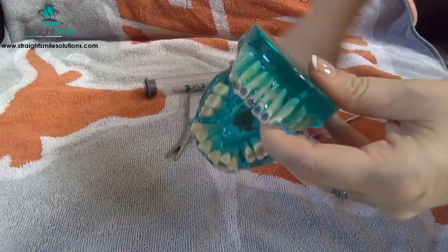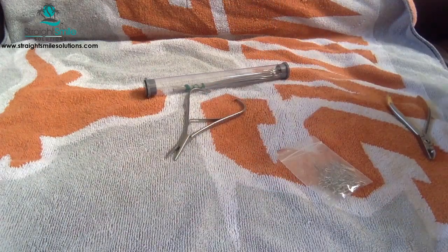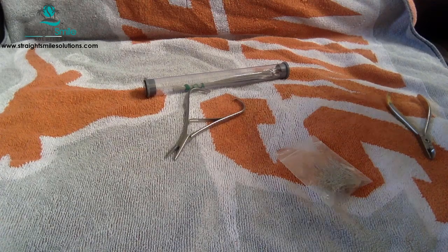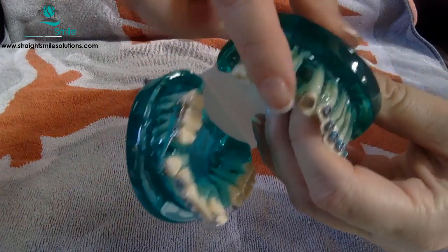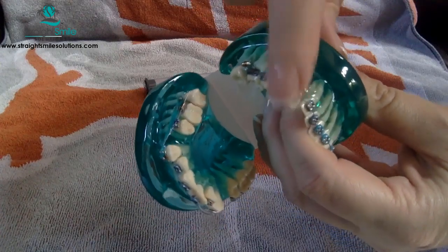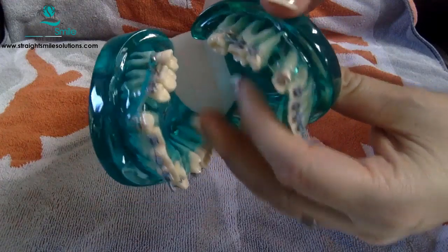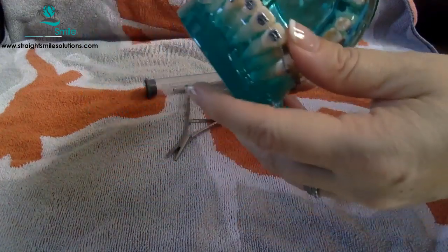You can see that. This is where the ligature director is really great. You're going to tuck it under the wire, and then you always instruct the patient that if it comes out or becomes pokey, to use a pencil eraser to tuck it back under. That's the safest way. They can't really mess anything up. It's not sharp now. You can see it's not sharp at all. Again, the nail is great. Go ahead and push it down. So that's how you use a ligature tie, a shorty.